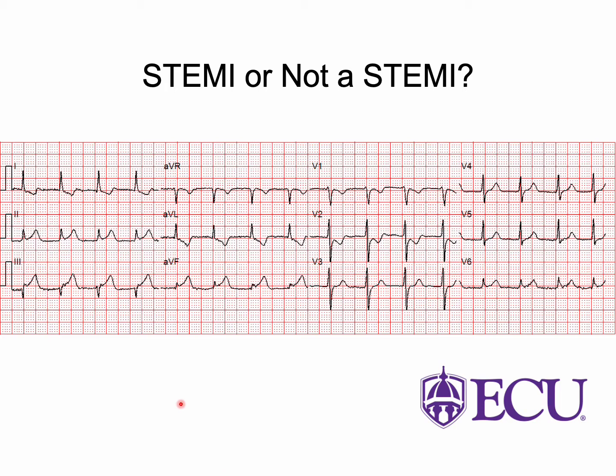Just to highlight some things, just looking at this right off the bat, we notice some concerning findings here, right? Looking at lead 2, we see a little bit of elevation in the ST segment there. Same in 3, same in AVF, right? We have some maybe reciprocal depression here in V2. This is a concerning looking EKG, right? This looks like an inferior STEMI, and in fact, this is a STEMI, right? Trust your gut. If it looks like a STEMI and the context is right, it's probably a STEMI. So this was called from the field, and this person did in fact have a STEMI. So that was a good call.